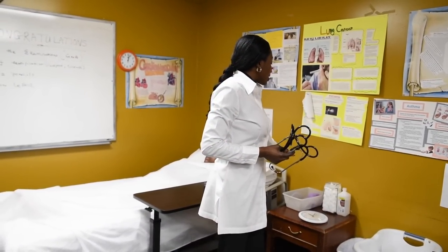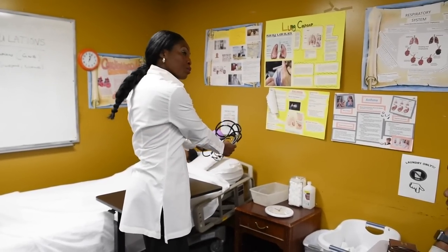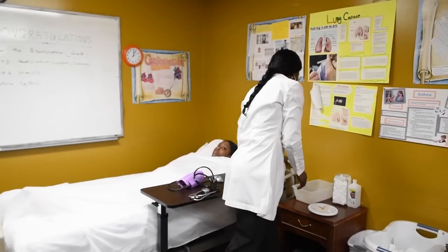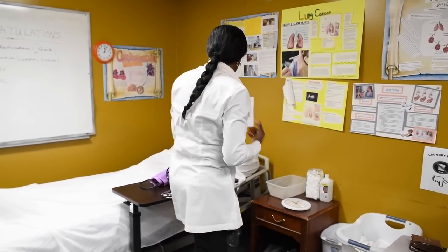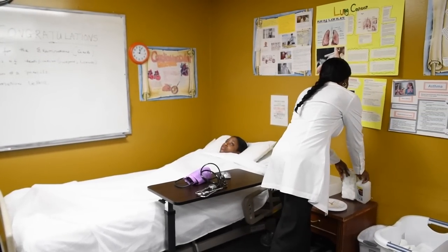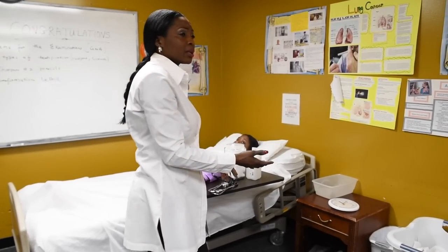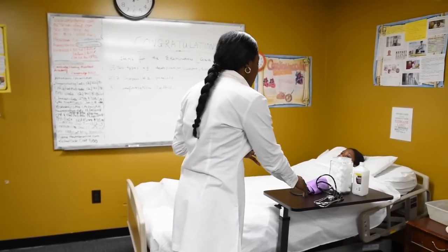So the blood pressure cuff, like we said, and the stethoscope, all this will be here for you when you come in. Cotton balls and alcohol, okay, are equipment as well, so write that down. Sometimes when I'm testing students for GNA, when it gets to blood pressure, they bring the clock. The clock with the second hand is only for pulse and what? Respiration, all right? So do not get those things confused.